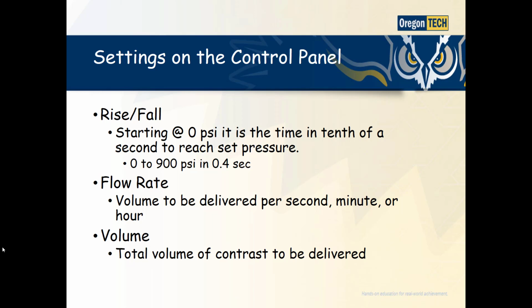The flow rate is going to be what is the volume delivered per second, per minute, or per hour. In the interventional suite and in the cardiac suite, you're going to see that we're doing injections of volume per second because we're doing large, fast, filling of large spaces.